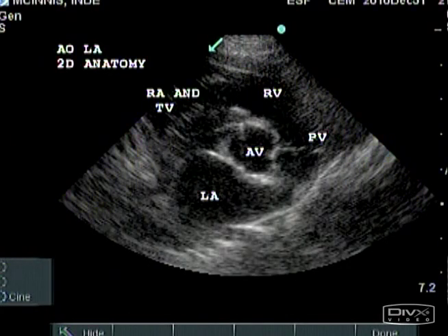Heart-based tumors are often noted in this view. Tumors may be in the right atrial free wall, at the interatrial septum in the left atrium, or at the left auricle. Lesions of the tricuspid, aortic, or pulmonary valve may be noted. The left atrium and left auricle may appear enlarged. The right atrium or ventricle may appear enlarged.